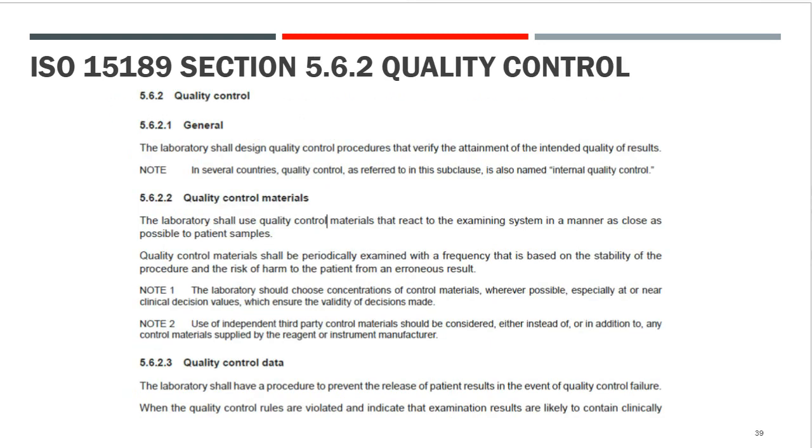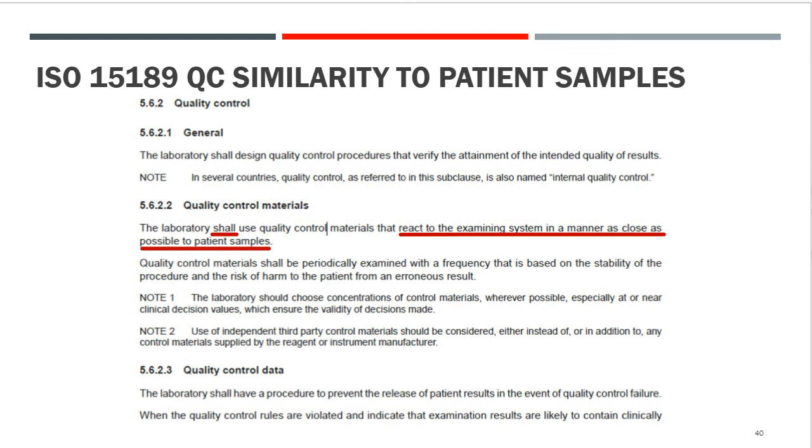A little bit on quality control. There's a lot in here. We'll focus on a couple. Here, section 5622. The laboratory shall, non-optional, you will do this, use quality control materials that react to the examining system in a manner as close as possible to patient samples.